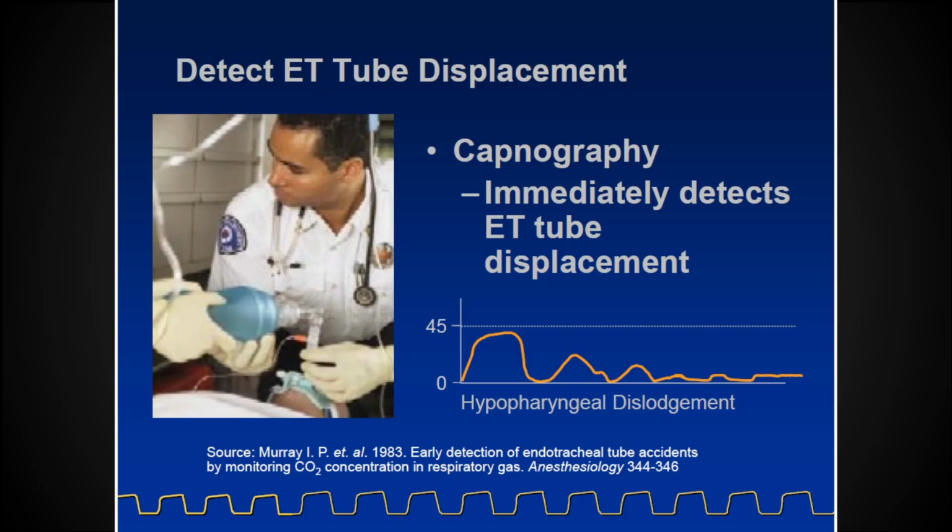Hypopharyngeal dislodgement essentially is talking about how it is unseated from its pharyngeal placement. So it's now, well, actually hypopharyngeal ET, below pharyngeal. Well, but it's at the hypopharynx, the laryngopharynx. It's the same thing. It's the lowest portion of the pharynx. I don't know.